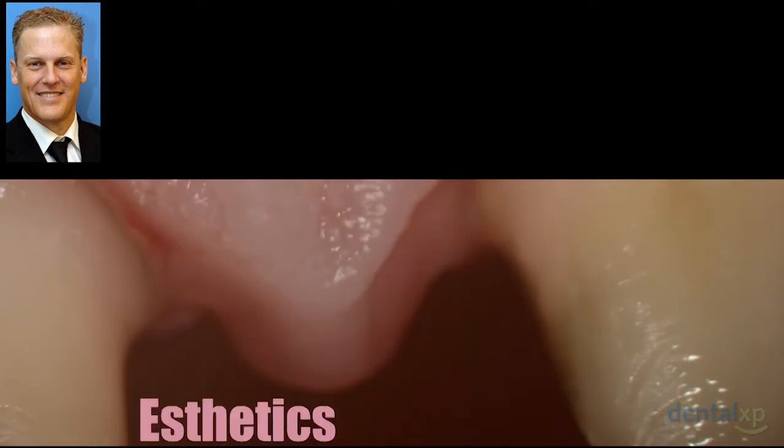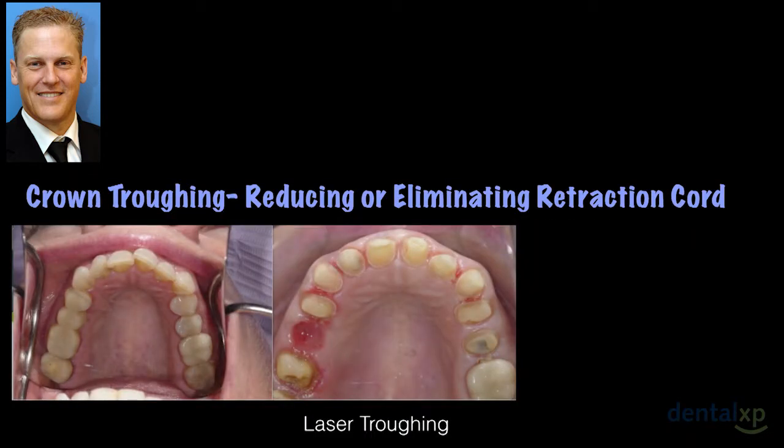So let's focus a little bit after that introduction on perhaps a couple things that lasers might do in aesthetics. Most of the time nowadays we are using a retraction cord as our tissue management device, but lasers can be used as an alternative or as an adjunct to create not only ovate pontics, but they can also be used to create tissue retraction in these particular cases.